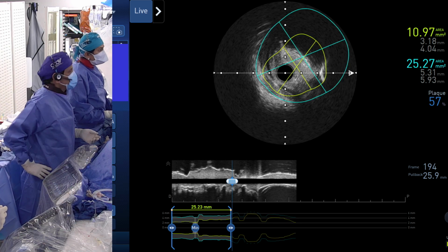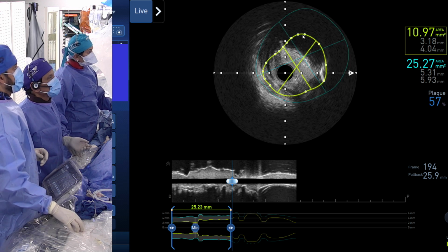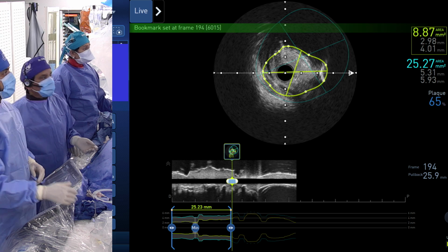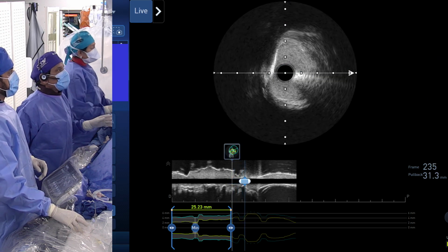Maybe, sir, they can just replay the full IVUS, because it was a very fast run, the new IVUS. Did you do 8 millimeter, 4 millimeter? 4. It's 4 millimeter. Let him play 1 second. Let's put a wire. We have it fixed at 4.